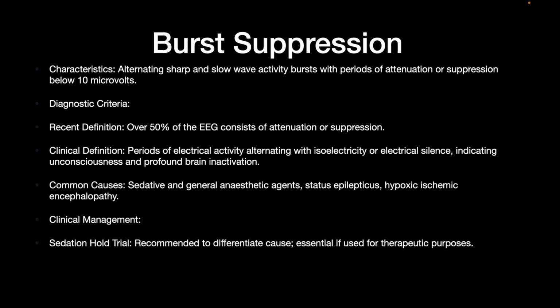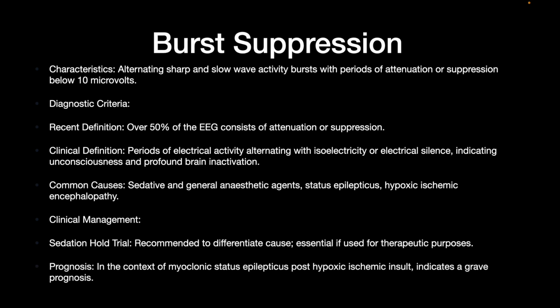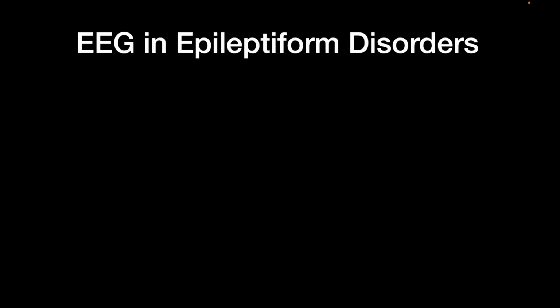The clinical management is to hold the sedation if the patient is on sedation, and in pathological cases it is the treatment of the underlying cause. In the context of myoclonic status epilepticus and post-hypoxic injury, the presence of this is a poor prognostic marker.